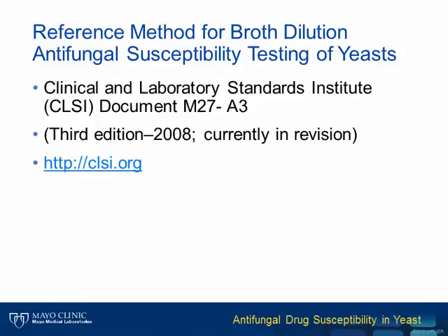In this hot topic, I will focus on the CLSI method and interpretive criteria, but I would encourage you to also visit the EUCAST website at www.eucast.org for more information on their standards.